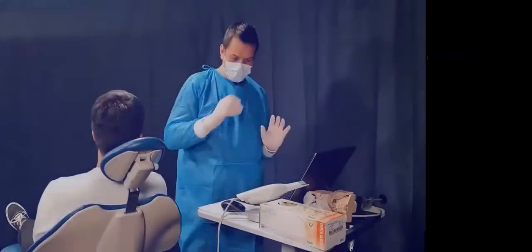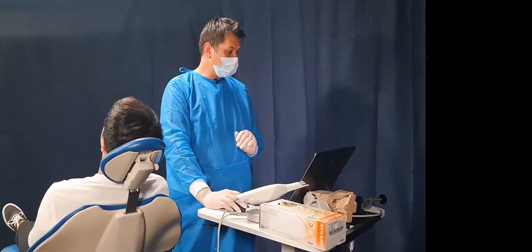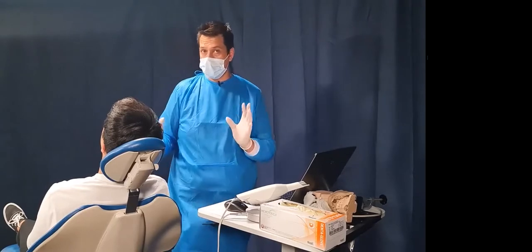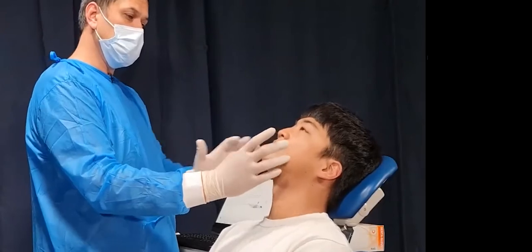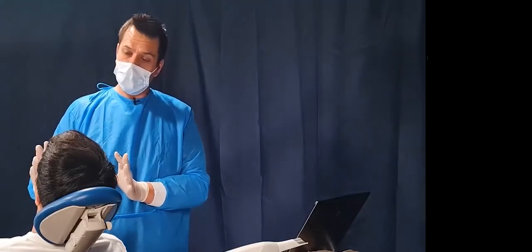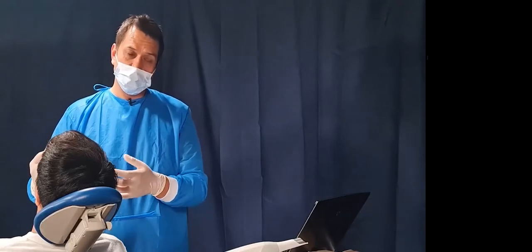Put my mask on. Now I'm going to delete out this scan and do the same thing, but with a real mouth. Now the real mouth is a little bit different. So if our cameraman can come in again, because now we're not just working with the mannequin, which just has teeth. The mannequin is a very good realistic way to do this, but when you've got lips, cheeks, tongue in the way, it does get a little trickier.